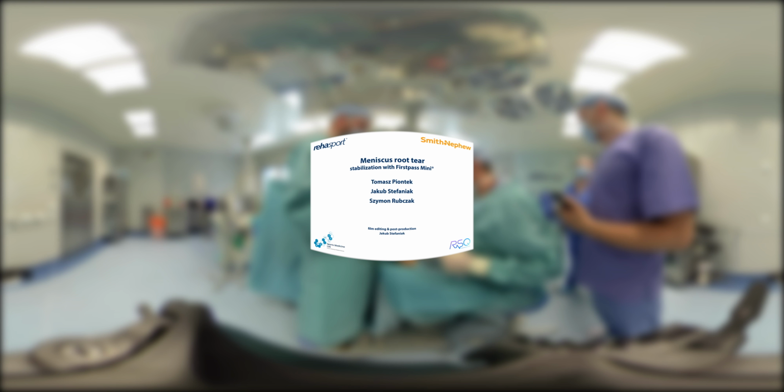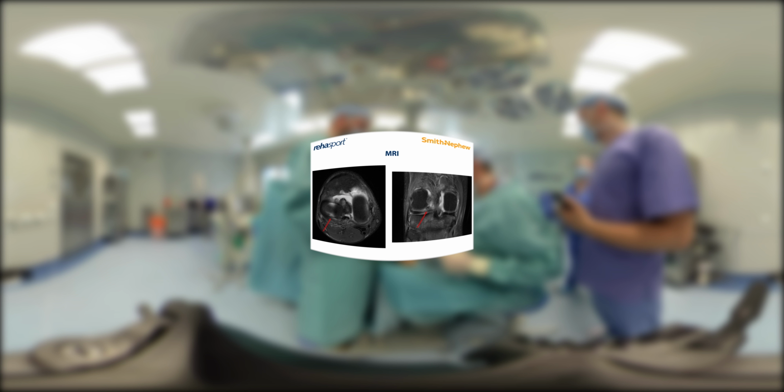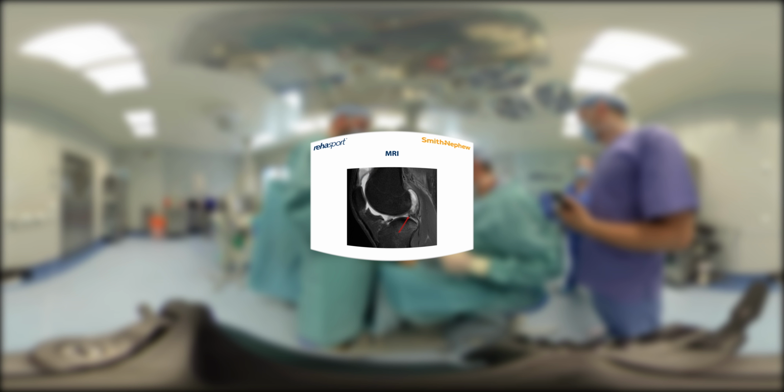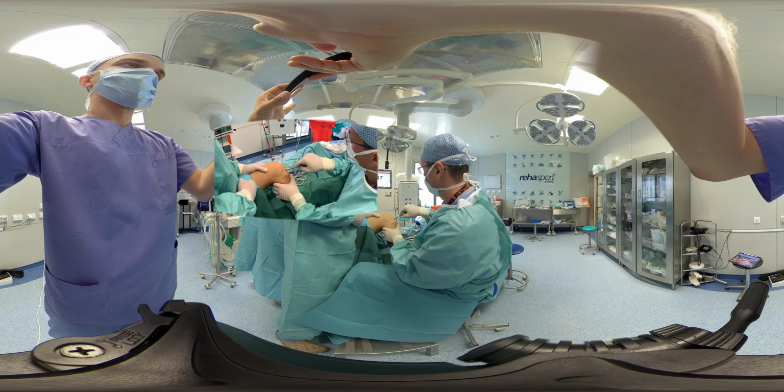We present you an instructional video for the treatment of the posterior root of the lateral meniscus. Patient 40 years after torsion trauma, 3 weeks in rehabilitation program. Symptoms of damage are also visible on MRI, marked with the arrows: damaged posterior root of the lateral meniscus. A very typical trauma of damaged meniscus and anterior cruciate ligament, ACL.